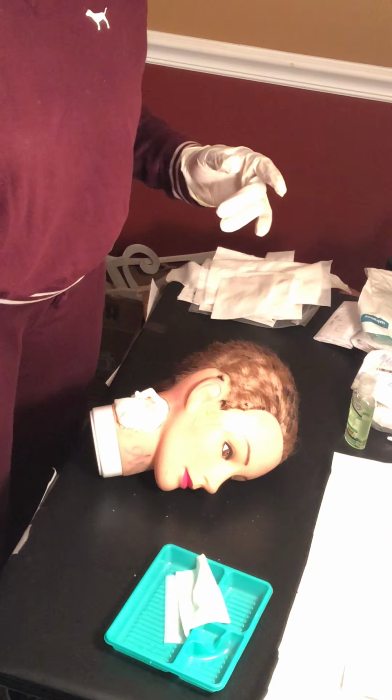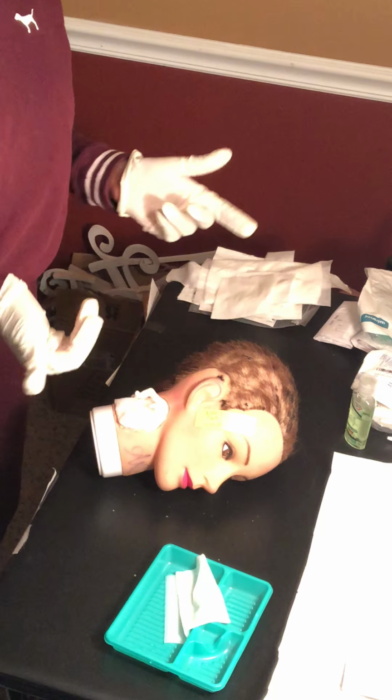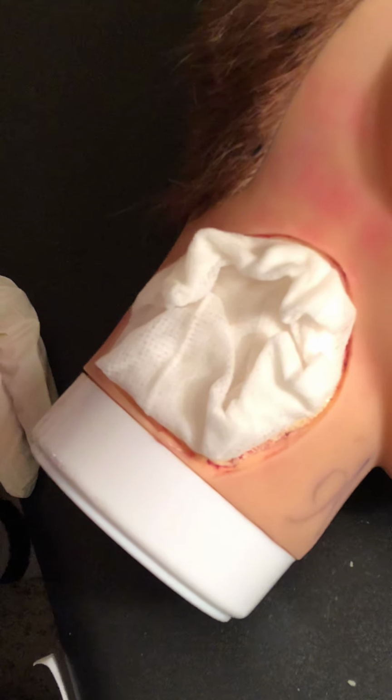I'm just gonna bring the camera closer so you can see. Of course, we know I'm about to contaminate my gloves, but it's just so you guys can see how I packed it in there. So don't even worry about that. I'm trying to keep it on here, so I packed it in there. It shouldn't go over. So that's that.